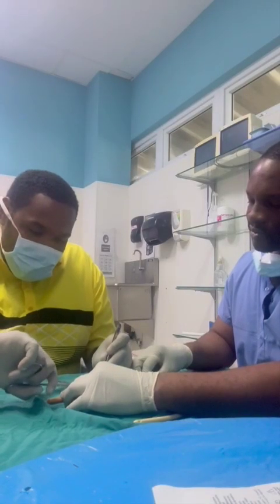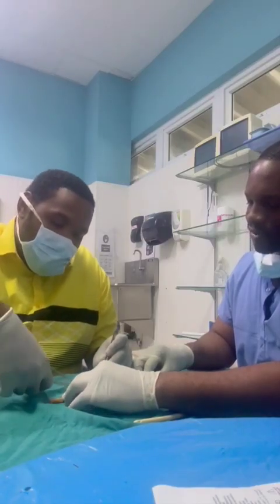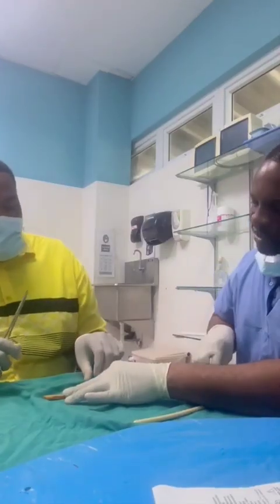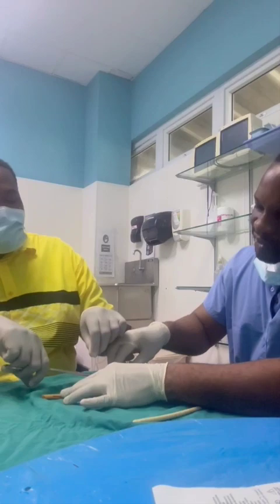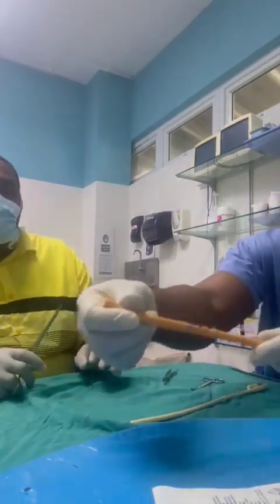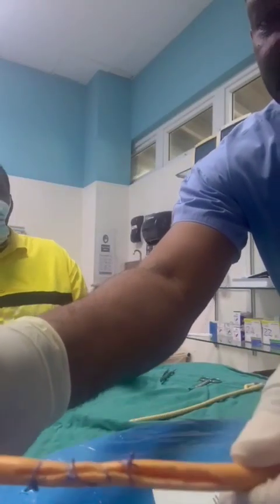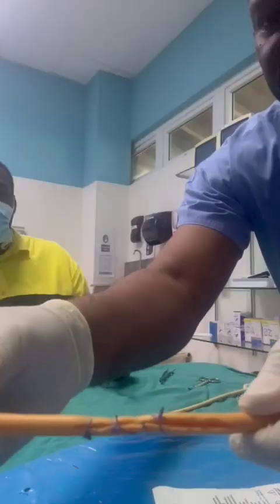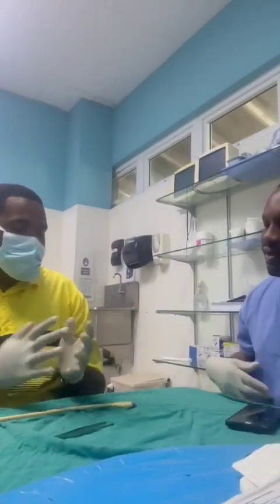So, 90 degrees, roll the wrist. Very good. And then we can cut that. How do you want me to cut it? 1 inch? 1 centimeter. Very good. Excellent. Brilliant. So this is Dr. R's suturing, interrupted and continuous suturing. It's very good. All right, Dr. R, that was very well done.